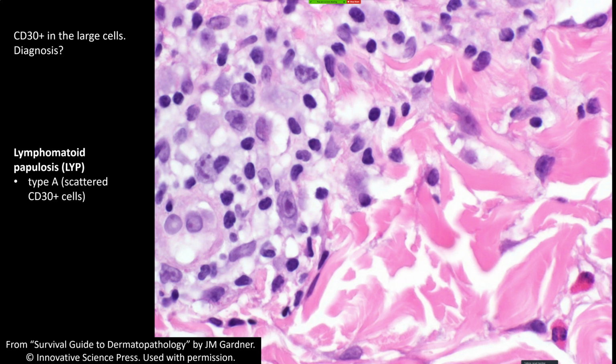So when I see that, and I don't feel like there are too many of them or that they're clustered together, or the clinical doesn't really make sense, I just put in my microscopic description that there are some scattered CD30 positive cells that I favor to be reactive lymphocytes, and that I think the number of those is normal for the density of this inflammatory infiltrate, okay?